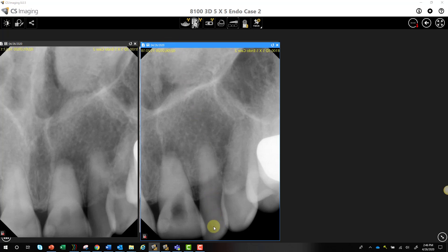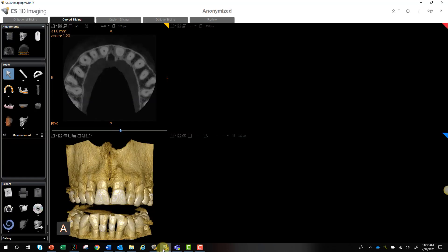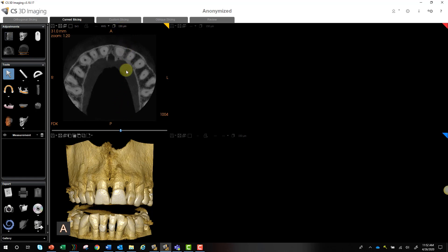The endodontist saw the PAs and elected to take a CBCT. On the CBCT, they actually took a 5x5 field of view on the 8100 3D. The scan was taken at 150 microns, although 75 microns could have been taken. We're going to go through the software a little bit to show you what was done.